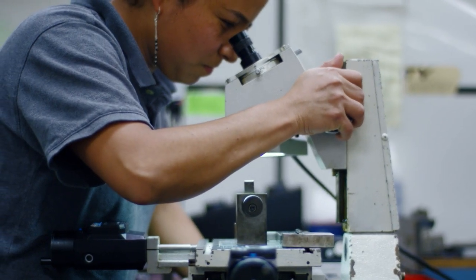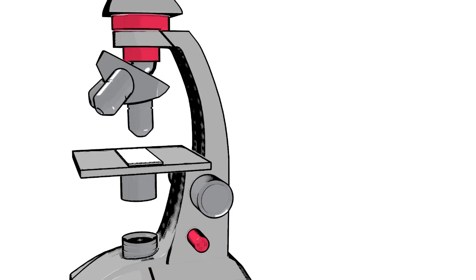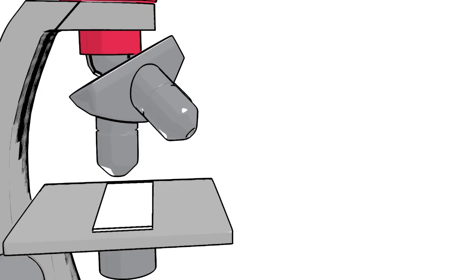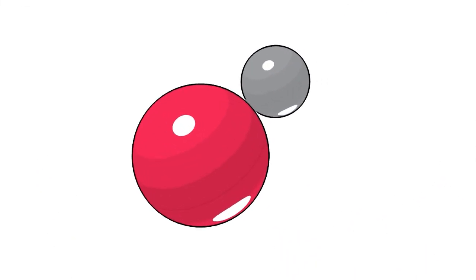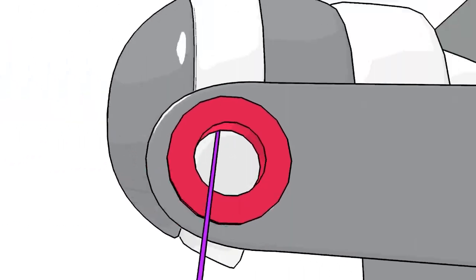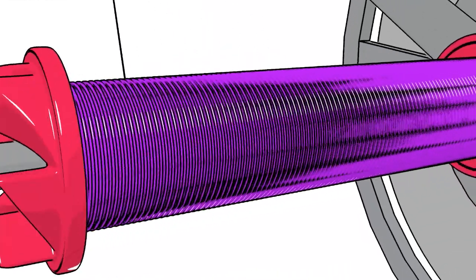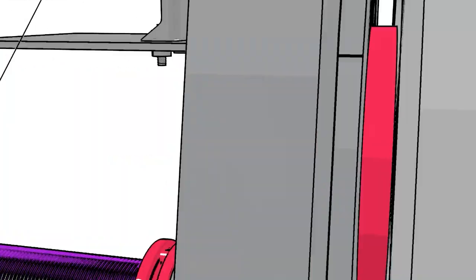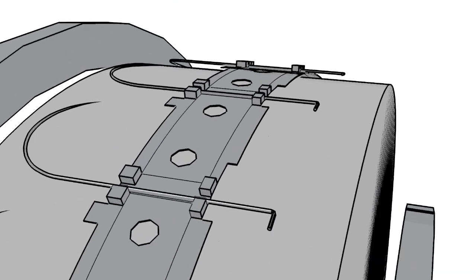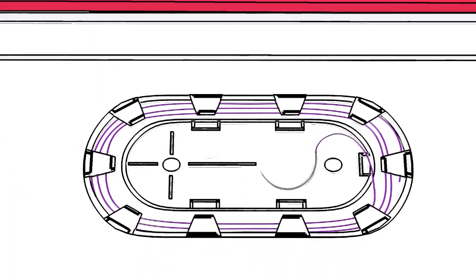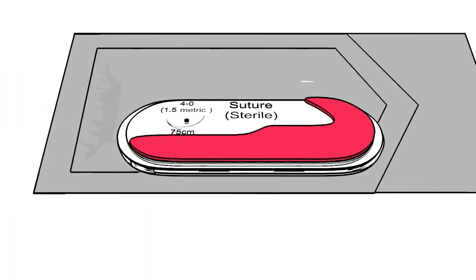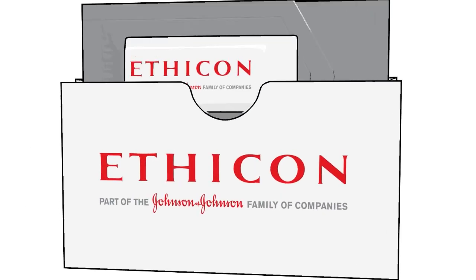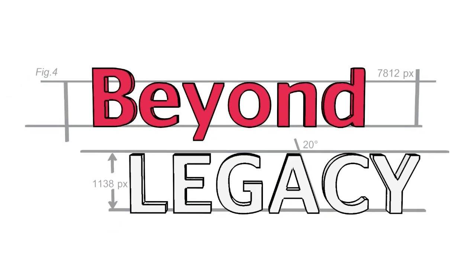In this three-part series, we'll go under the microscope to reveal how Ethicon sutures are actually made and how through premium needles, advanced packaging, and consistent performance, they have become the wound closure product that surgeons trust.